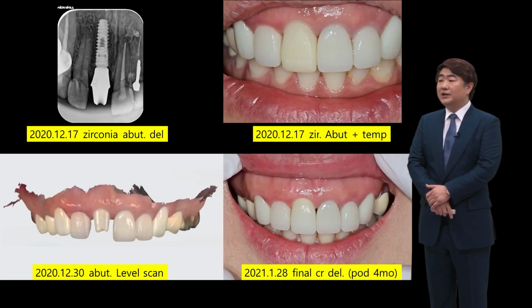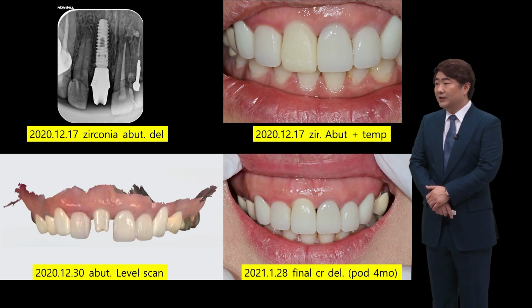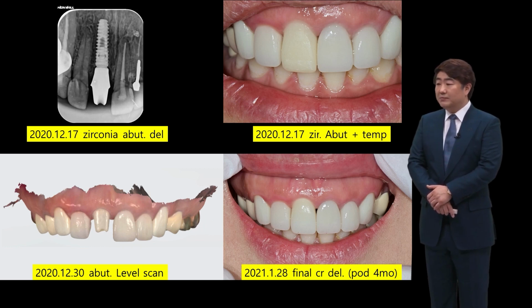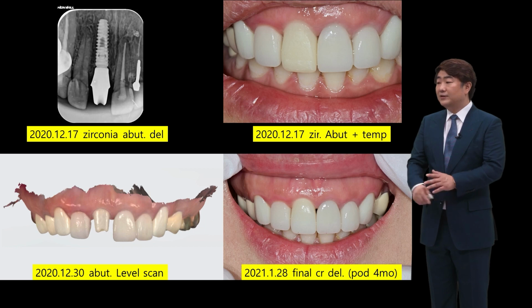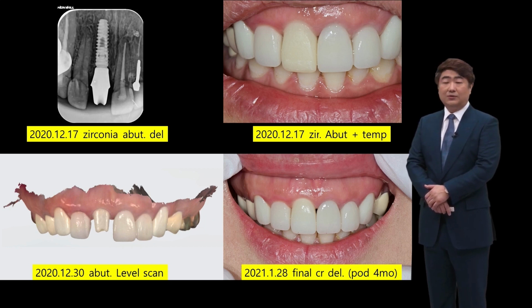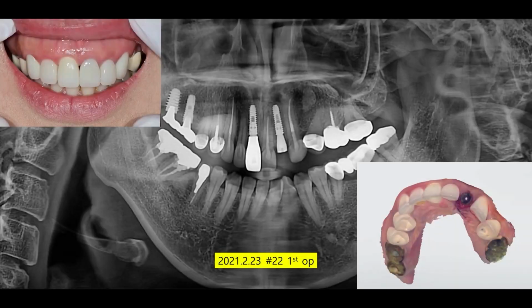Hence, in December, a zirconia abutment was used, and I put it in for now as a temporary. And then I got feedback from the patient. He wore it for 2 weeks, and then I did an abutment scan, and the final was delivered in January, 4 months later. But I did that for number 11, but then number 21 had a crack.